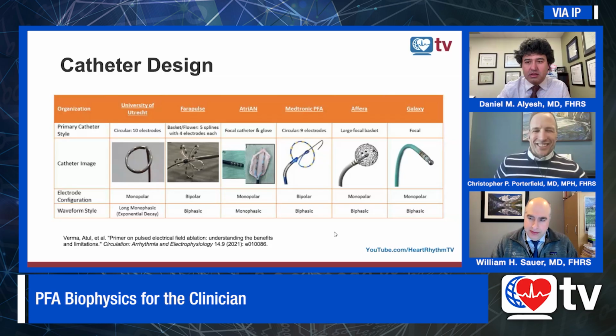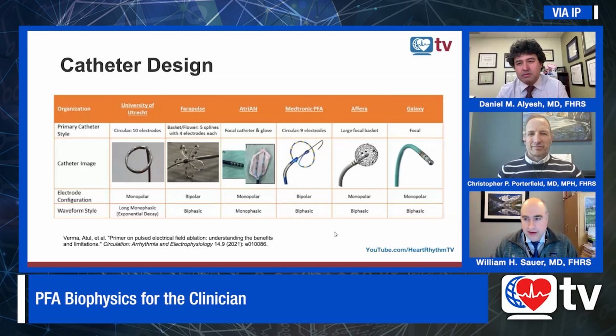Yeah, no, I think no general anesthesia is fine if you're not going to use electroanatomical mapping, but the patients are going to move, and so that can be frustrating. But yeah, I think in Europe they're doing it a little bit more, just using fluoroscopy and the wire-based FARAWAVE.